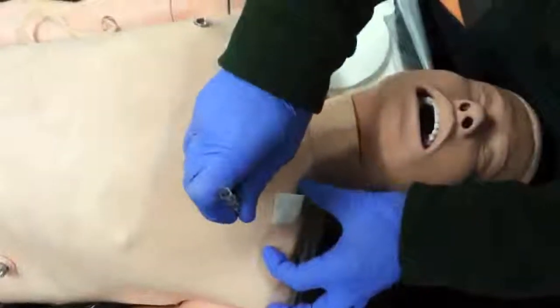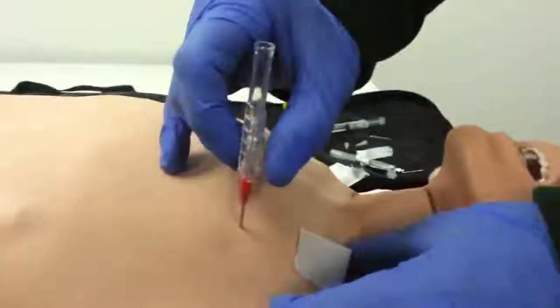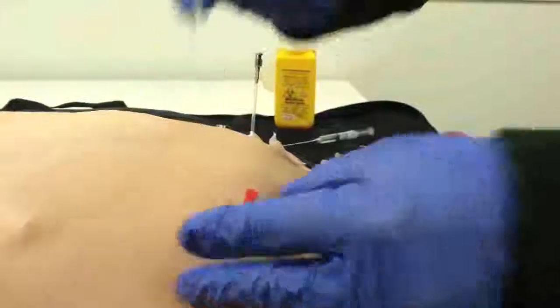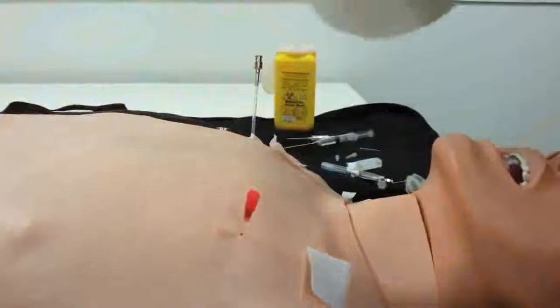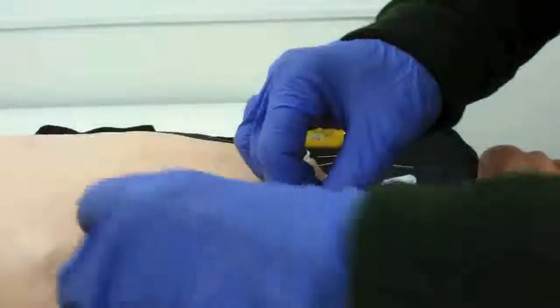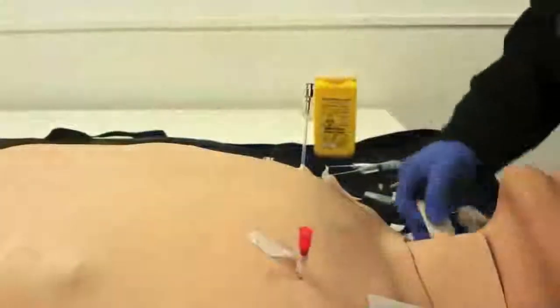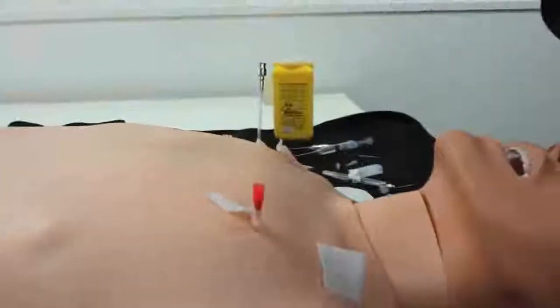Angling in slightly towards the vertebral column, advancing. What you should hear is a little bit of a hiss, which is all the gas escaping. We should be able to advance that slightly. Popping the needle away into the sharps container there. Then you tape it in, and we're going to pop the chest seal over the top.